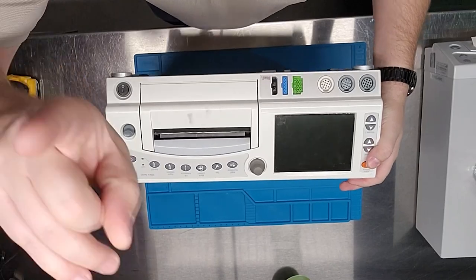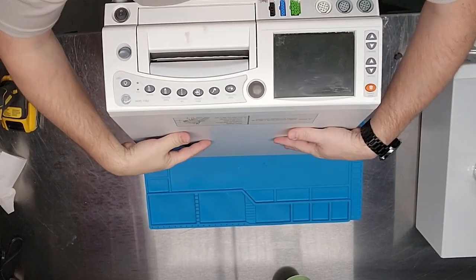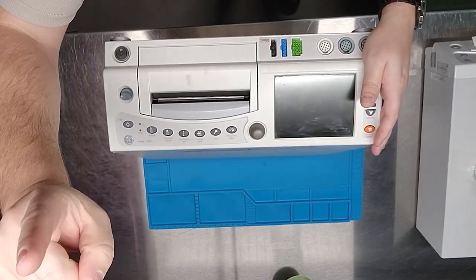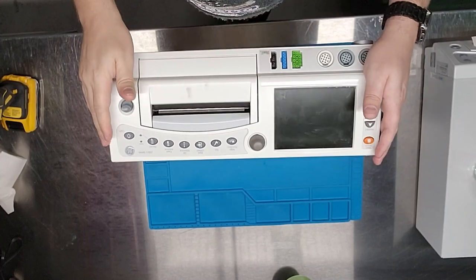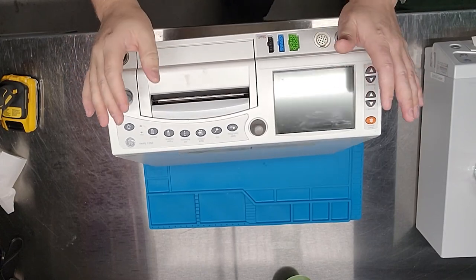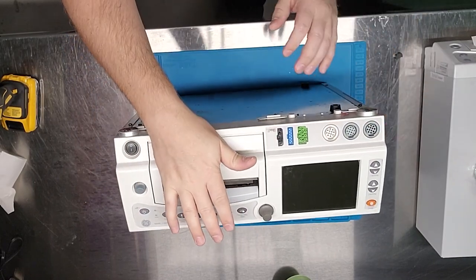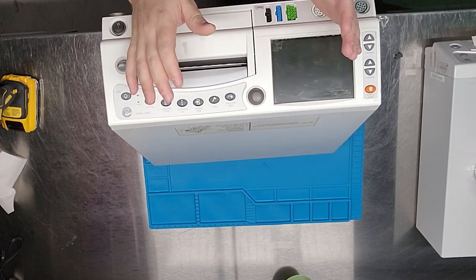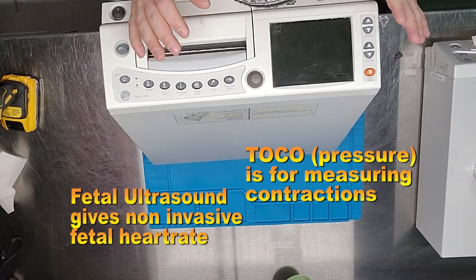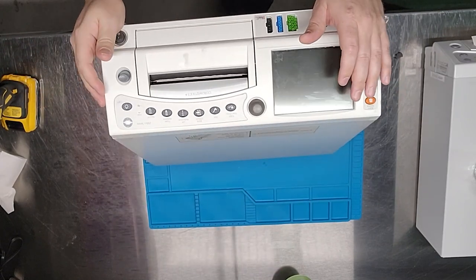I'm using an overhead camera for the first time in this orientation, because I need the camera a little further away to capture everything inside. This right here is the GE 250CX fetal monitor — very typical, you're going to see this in all sorts of mother-baby wards. It does a lot of different functions: ultrasound, toco, and more. We'll take a look at some of the boards that control that functionality.